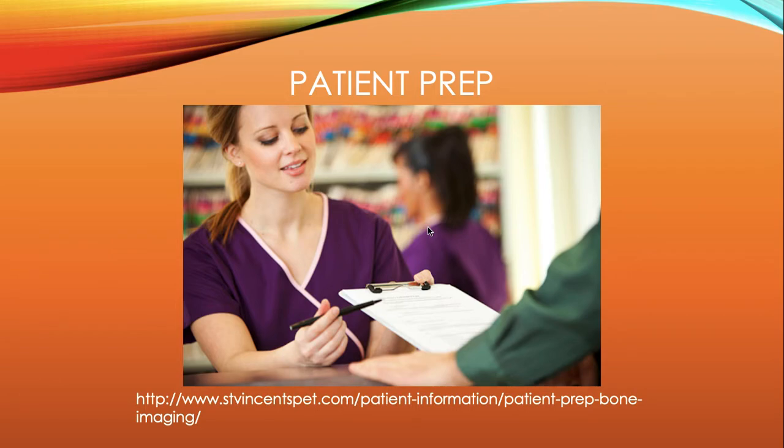So, patient preparation. There are no specific preparations for having an IOC, but like I said before, IOCs are always done after a patient has their gallbladder removed. So there are preparations for when the patient is having a cholecystectomy. The patient is going to have to talk to their doctor to see if their health is okay for surgery. The patient is told the risks and the benefits and will also have to sign a consent form.